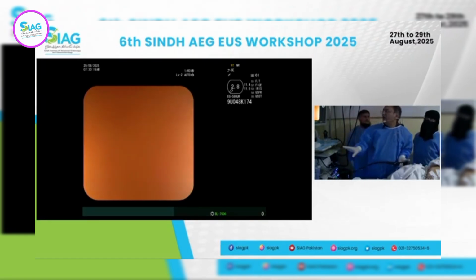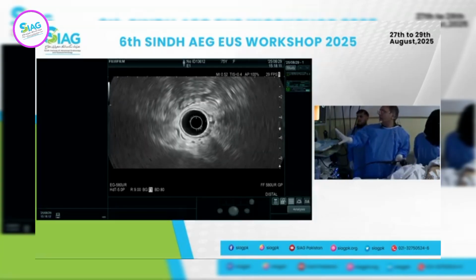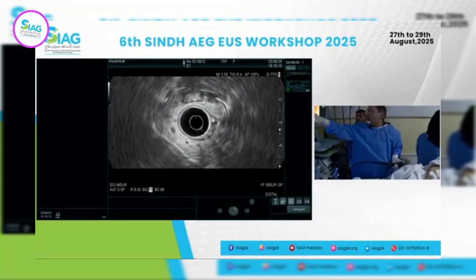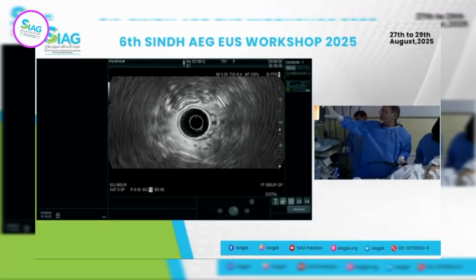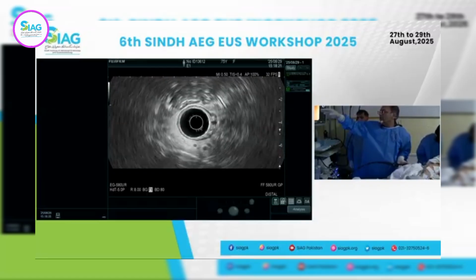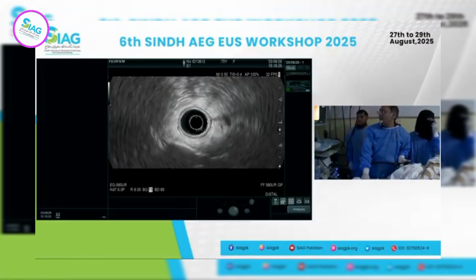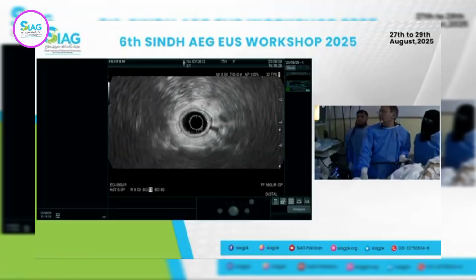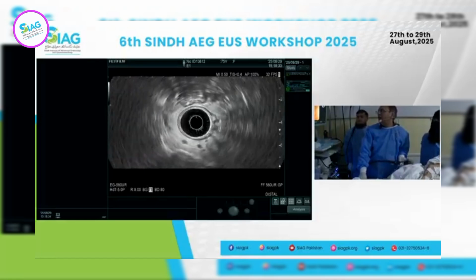We have it. So here one thing I did is I completely collapsed the rectum. The wall is coming along very nicely around the probe, so I'm just going to stick to that. I don't need to fill in with water. If needed, we can put the water in there, but I think right now we're going to be fine.